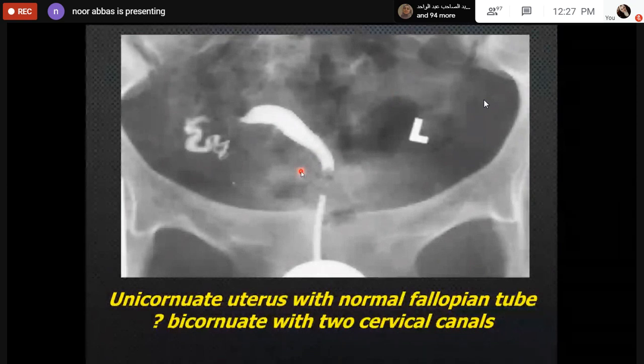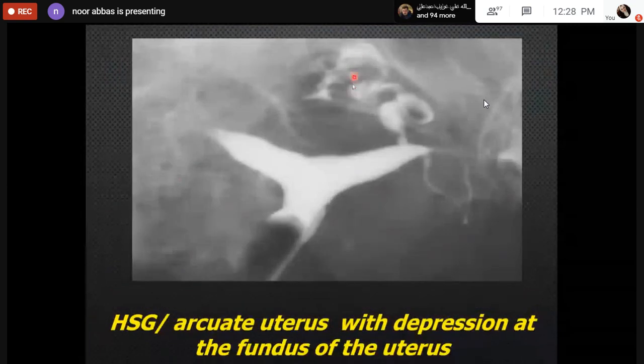حاليا المين رول is for assessment of tubal patency يعني patient with infertility حتى after exclusion of hormonal and ovarian causes راح يسوون هيستروسالتن to assess for tubal patency. راح يشوف التوب is it obstructed or is it patent. شلون اعرف انه obstructed or patent؟ اشوف هذا اللي هنا الكونتراست اللي يطلع من هذا التوب لاحظ ان هذا التوب is patent بدي اشوفه كله واكو سبلج البريتونيال كافيتي في التوب while this tube is blocked. I cannot visualize the tube, I cannot see spillage.